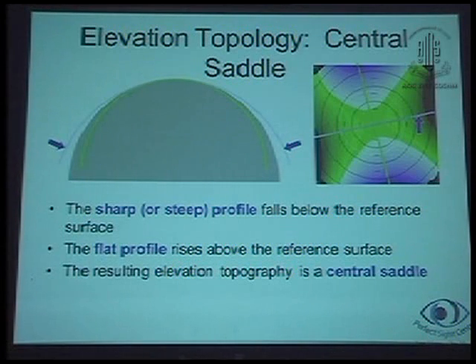The central area is the normal cornea, normal elevation, which is green for both. You see the sky blue one, the periphery is anterior to, or above, the best fit sphere, more elevated than it. So this would become redder. So this is how an elevation topography would look.